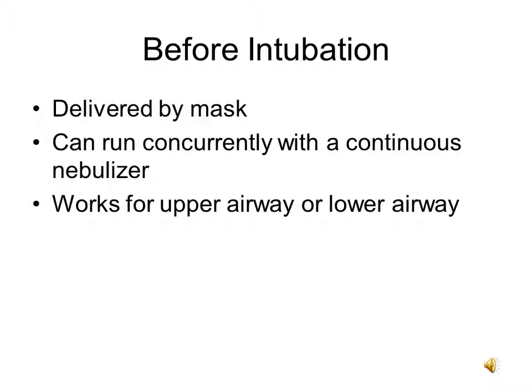And much like non-invasive ventilation, the use of Heliox can stave off impending respiratory failure until other adjuncts such as bronchodilators or IV steroids can take effect. Also like non-invasive ventilation, it's designed to be used in the short term for impending respiratory failure and works best when the patient needs a relatively moderate amount of help, rather than for the patient who is already in full-blown respiratory failure.